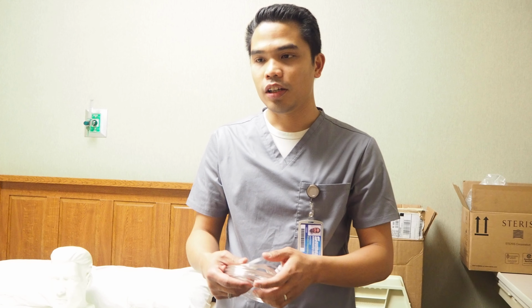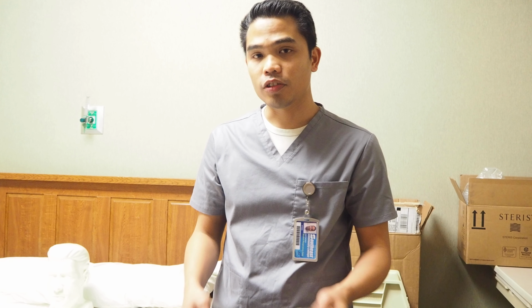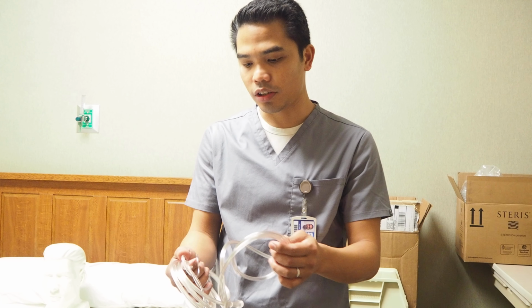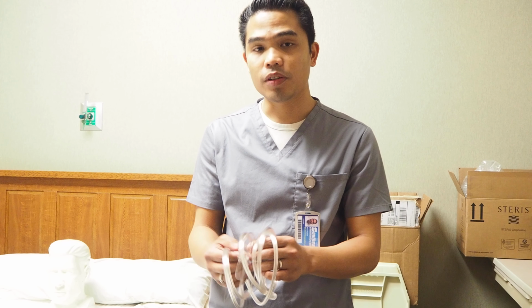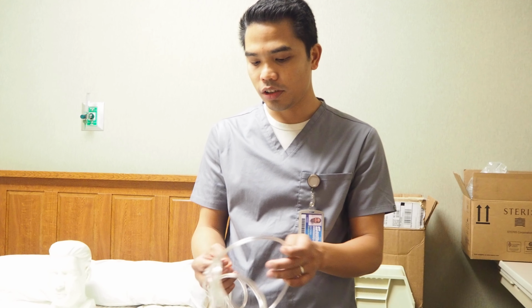Before I go inside the patient's room, I always check the chart to ensure that the physician really ordered it. And then I also have to double check everything, such as any information. Once inside, I always introduce myself and explain to the patient what I'm trying to do, by telling them that the physician would like to hook them up with oxygen just to relieve them from difficulty in breathing, and it would also improve their oxygenation.